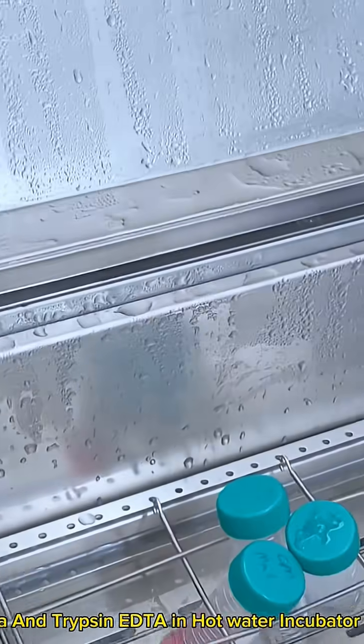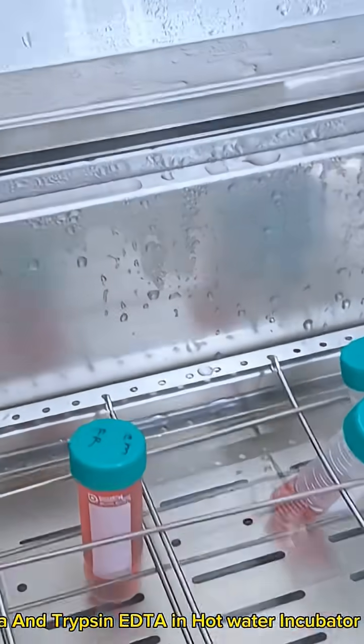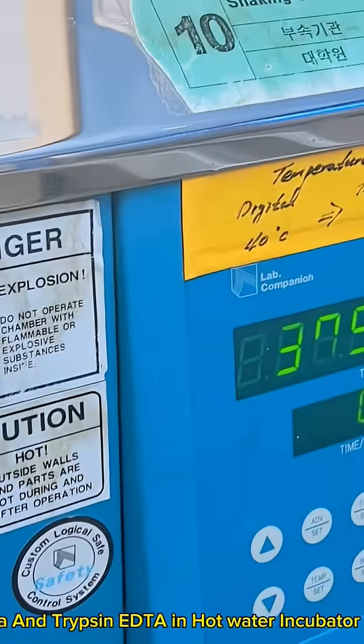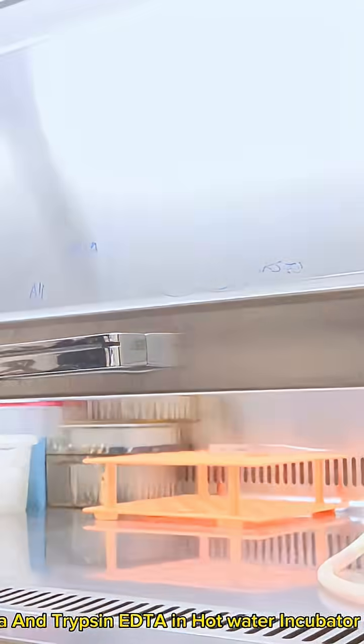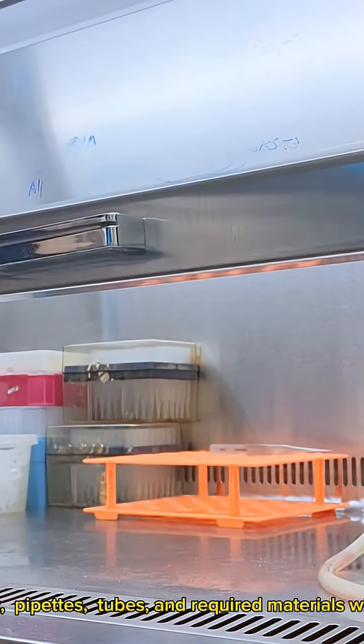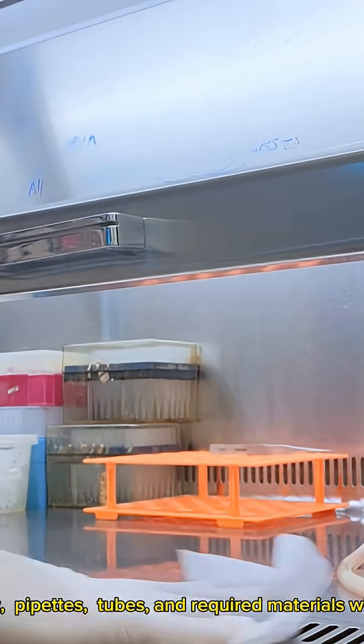Put PBS, complete media, and trypsin EDTA in a water bath at 37 degrees Celsius for 30 minutes. Clean the biosafety cabinet, pipettes, tubes, and required materials with 70% ethanol.